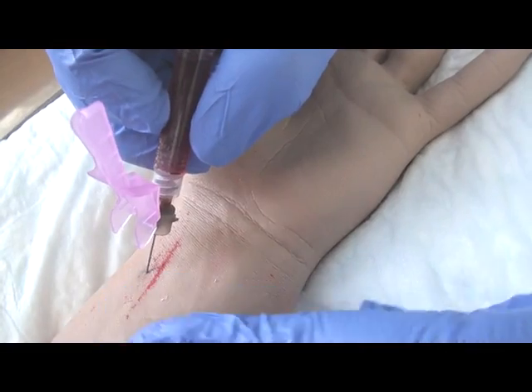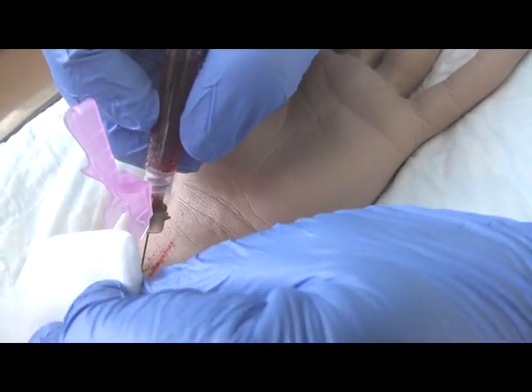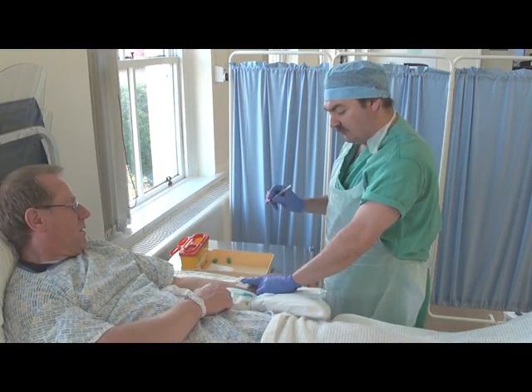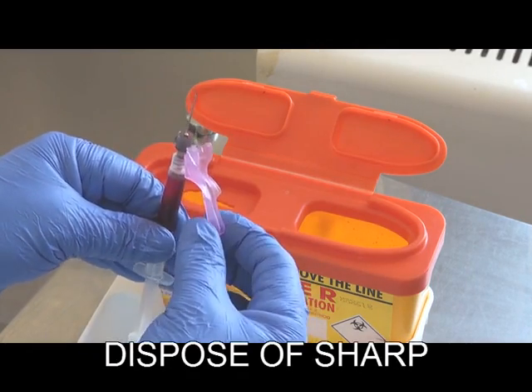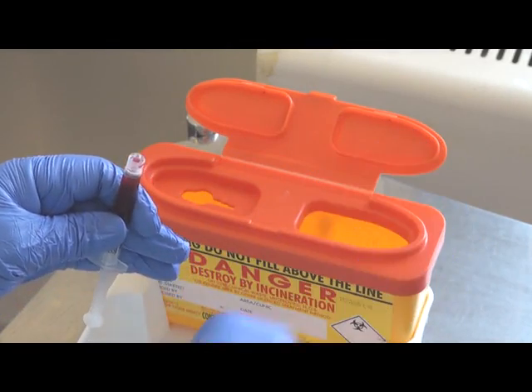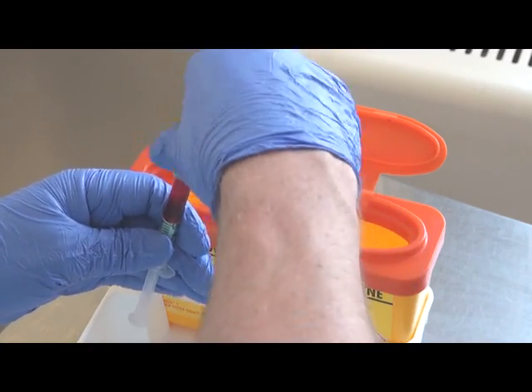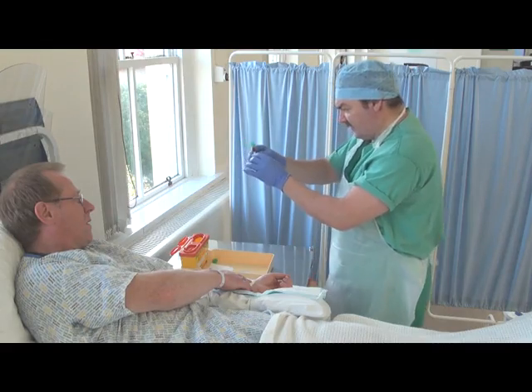Once the sample is collected, apply sterile gauze to the puncture site. Pressure must be applied for at least 5 to 10 minutes. Carefully dispose of the sharp to a sharps box. Carefully remove any air bubbles in the sample and cap it off from the atmosphere. Make sure you mix the sample properly.